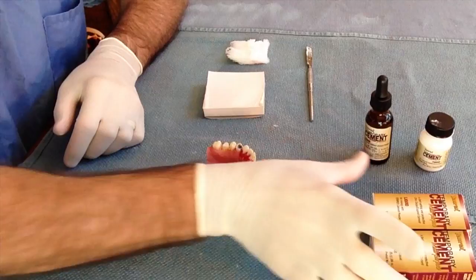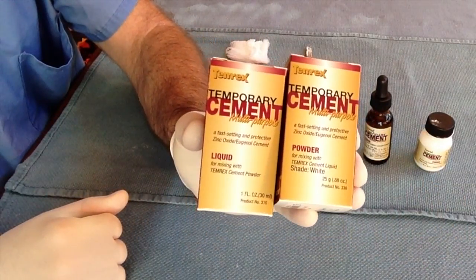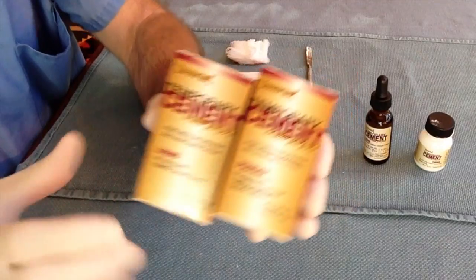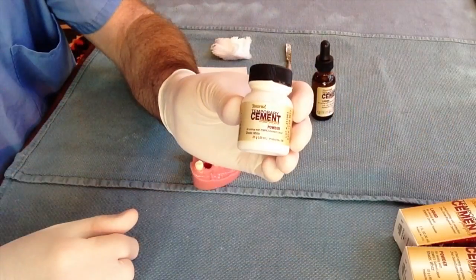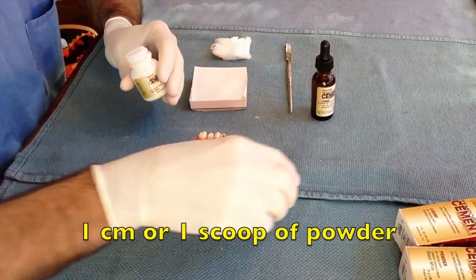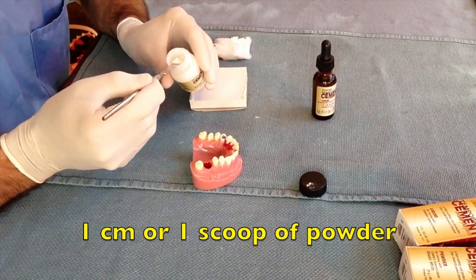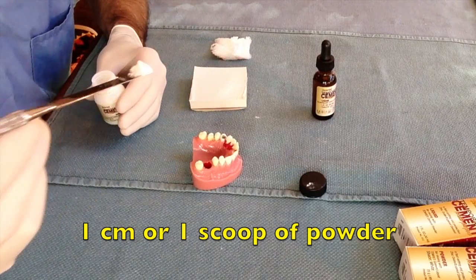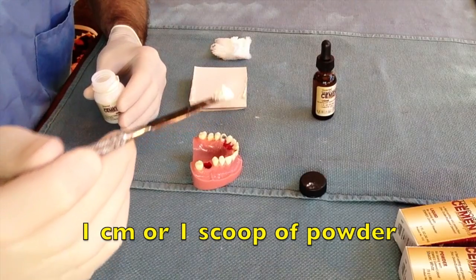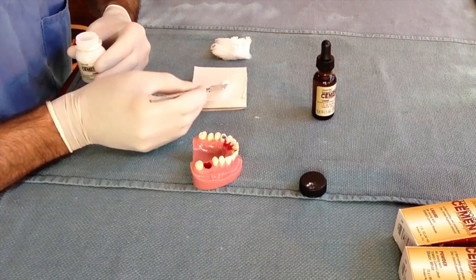The Temerex in the dental box consists of a liquid and a powder, which requires mixing to activate its adhesive properties. Using the stainless steel spatula, scoop approximately 1 cm of powder and place it on the mixing pad. This is equal to approximately 1 scoop of powder if you are using the enclosed scoop.